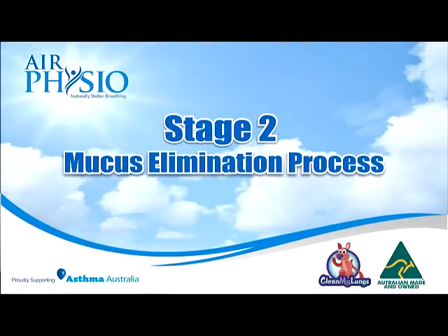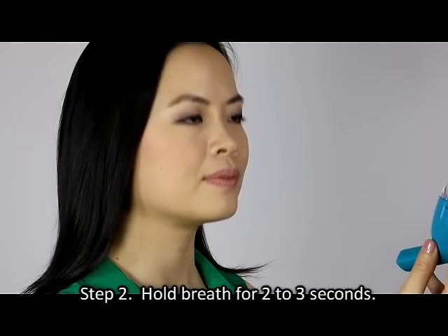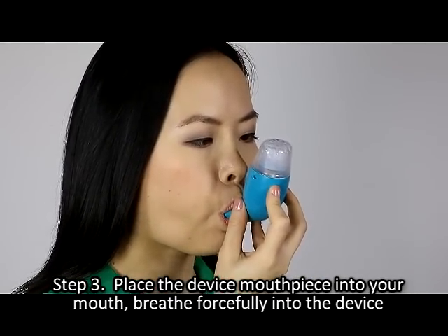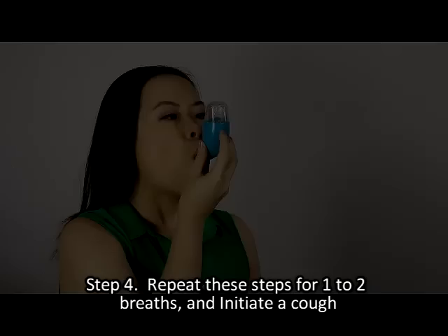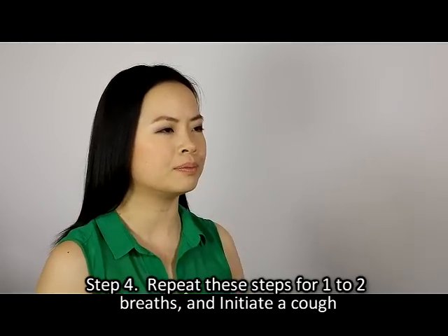Stage 2: Mucus elimination process. Step 1: Breathe in slowly, filling your lungs completely. Step 2: Hold your breath for 2 to 3 seconds. Step 3: Place the device mouthpiece into your mouth and breathe forcefully into the device, adjusting it until you feel the maximum vibration within the chest, keeping your cheeks stiff. Step 4: Repeat these steps for 1 to 2 breaths and initiate a cough.